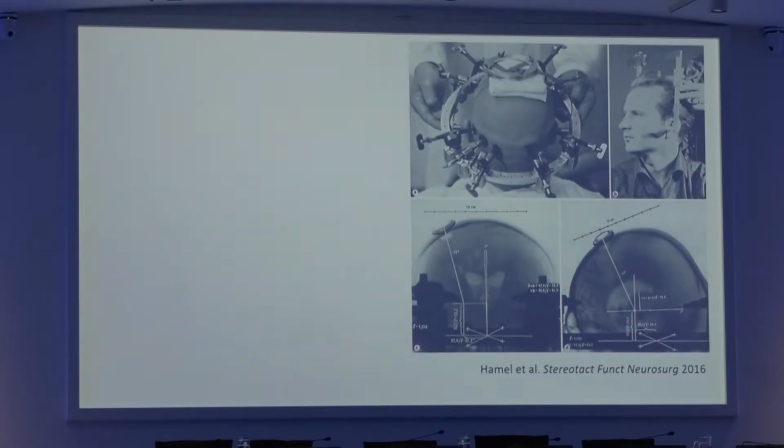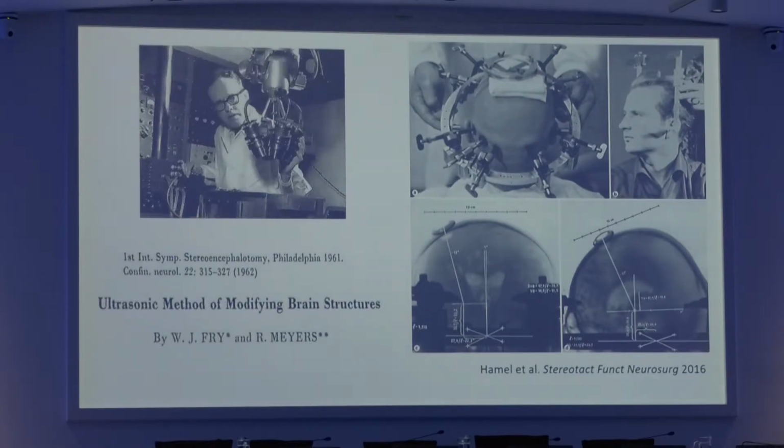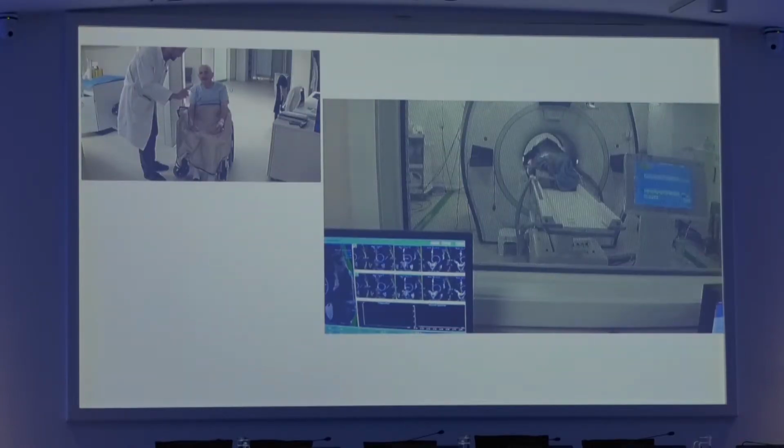This is a novel technology, even though it's the combination of two classical concepts. The first one is the history, decades of history of ablative neurofunctional surgery. At the time, decades ago, lesions were made to treat neurological and psychiatric conditions, but surgical intervention was needed. And the other concept is the use of ultrasound to do those lesions. It was pioneered in the 50s by the Fry brothers in Illinois, and the main limitations at that time were that an acoustic window was needed because the beams could not pass through an intact skull, so surgical intervention was needed, and there was no radiological guidance. There was no MRI, so the accuracy of the lesions was pretty low. Now, we have overcome these limitations, and we can use it in clinical practice.